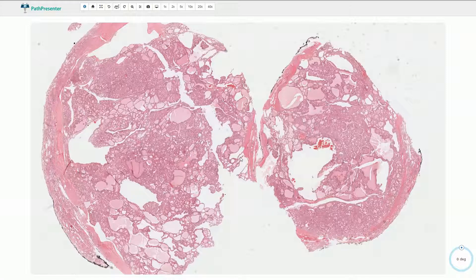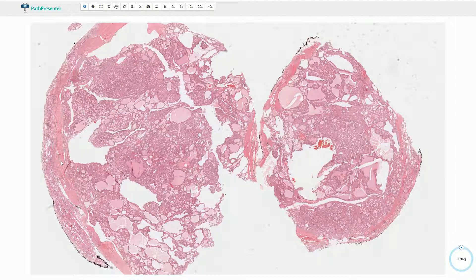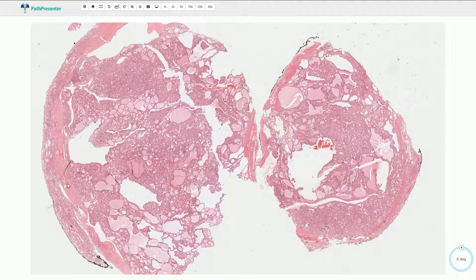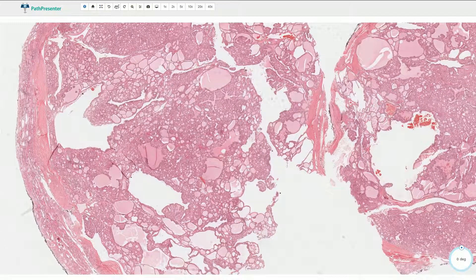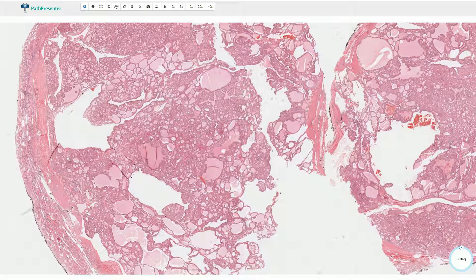Here we have the case of follicular adenoma. It is a benign lesion, usually solitary, well circumscribed, and associated with a relatively thick, well-formed fibrous capsule. This well-formed and complete fibrous capsule is what differentiates follicular adenoma from adenomatoid nodule. Another useful feature is that the cells of the follicular adenoma usually have different architecture and different appearance than those of the cells of the adjacent thyroid parenchyma.